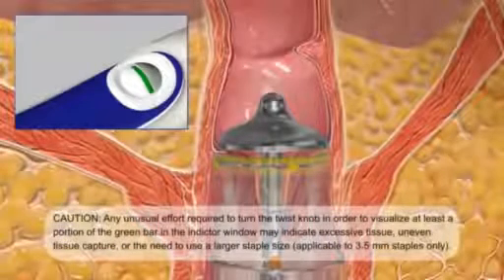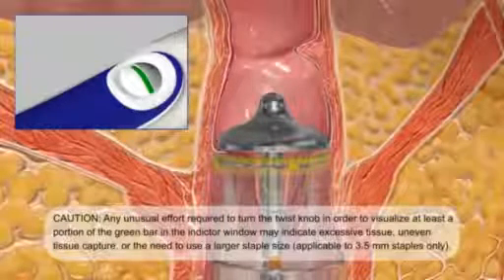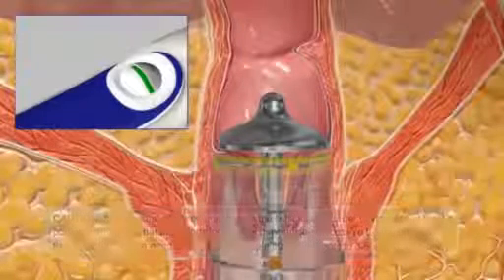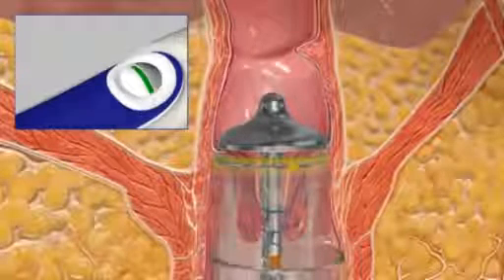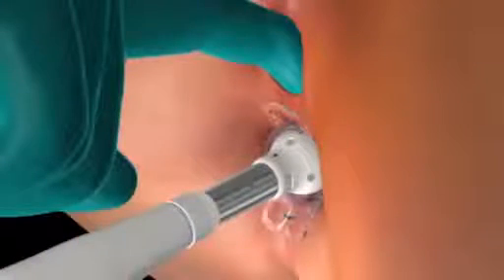CAUTION: Any unusual effort required to turn the twist knob in order to visualize at least a portion of the green bar in the indicator window may indicate excessive tissue, uneven tissue capture, or, if using the 3.5mm stapler, the need to use a larger staple size. The safety will not release if the green ready-to-fire indicator is not visible. To ensure that the green bar remains visible in the ready-to-fire indicator window, do not turn the twist knob once the safety is released. Again, for female patients, digitally inspect the tissues captured transvaginally to ensure that recto-vaginal tissues have not been captured in the device.